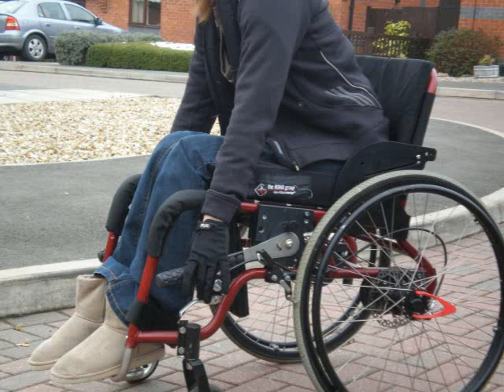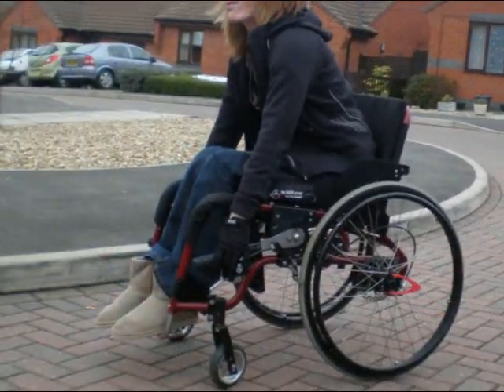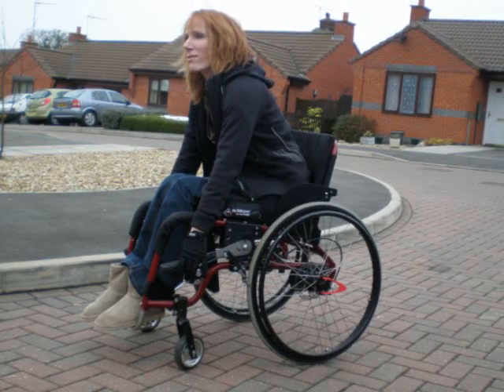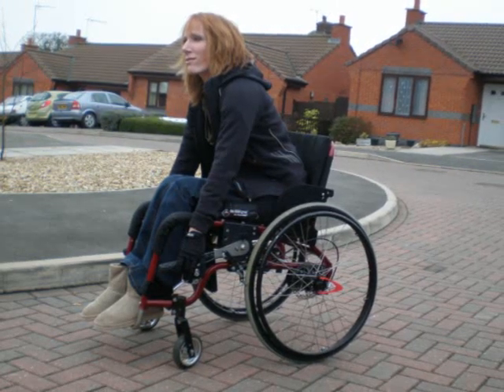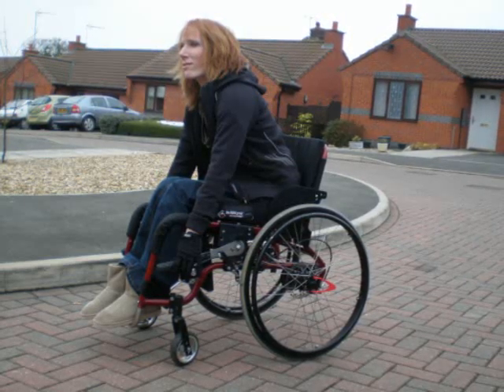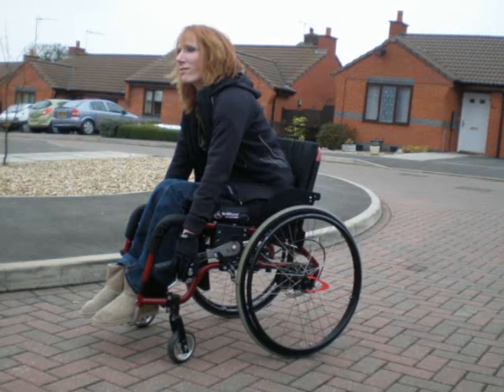Some wheelchair users, when learning to use the Wilgo wheelchair with the handles engaged, will continue with the lunging forward motion experienced from their conventional wheelchair. The correct posture is to sit upright, and in this position, very few wheelchair users will ever be able to lock down the handles without lunging forward.